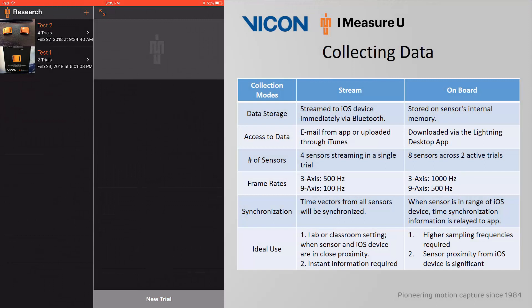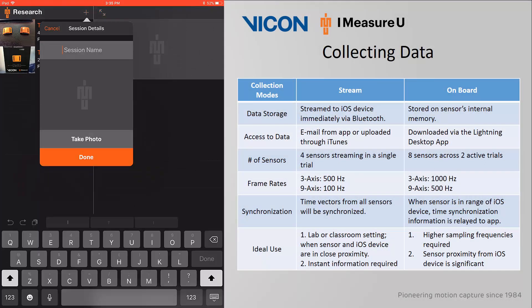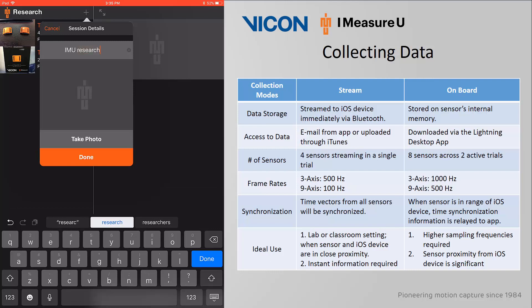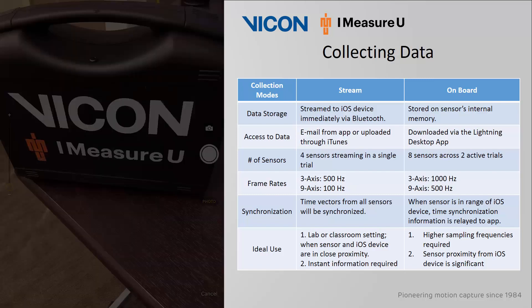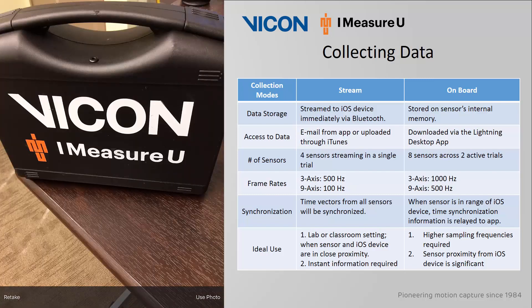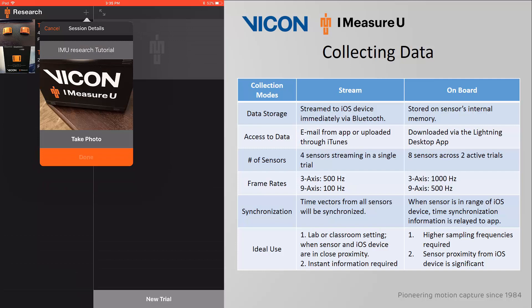To start collecting data, you must make sure to have a session. To create a new session, click on the plus icon at the top. You will be prompted to enter a session name — I will type in IMU Research Tutorial. You also have the option to take a photo using your device's camera so that you can easily identify your session within the list on the left. When satisfied, click Use Photo and then click Done.